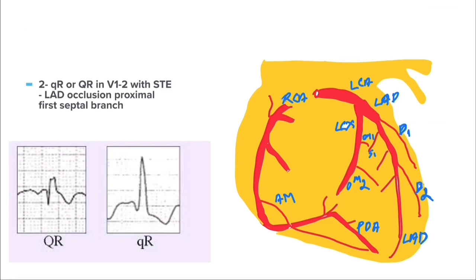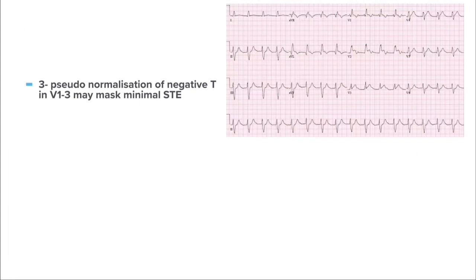The QR pattern in lead V1 or V2 with ST elevation is another important finding. The presence of a QR pattern in V1 or V2 with minimal ST elevation indicates left anterior descending artery occlusion proximal to the first septal branch. Additionally, pseudonormalization of the negative T wave in leads V1 to V3 may mask minimal ST elevation — we already discussed that T waves are inverted in V1 to V3 in right bundle branch block, so in the presence of ischemia this T wave becomes upright (pseudonormalized), which can mask a very minimal ST elevation in V1 to V3.